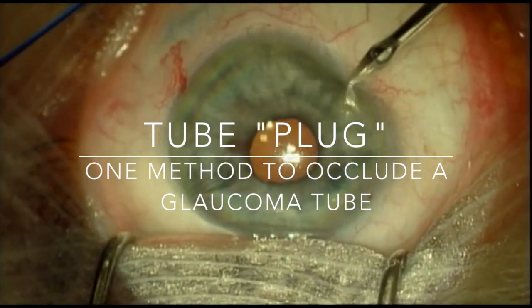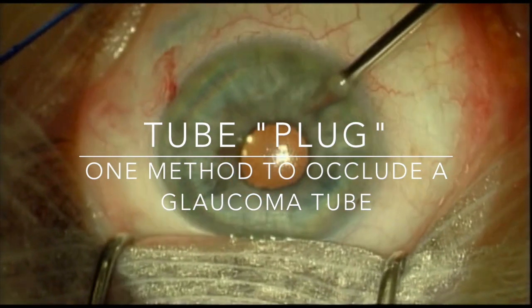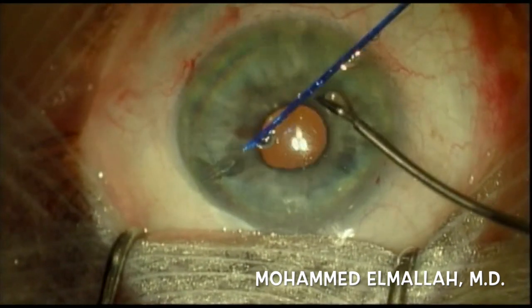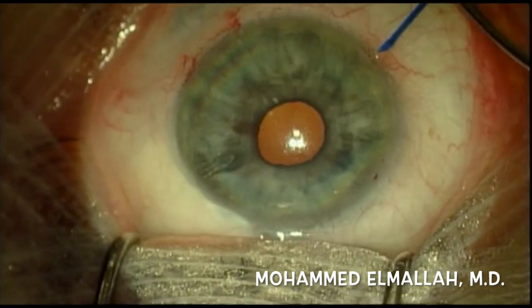This is Mohamed Elmala. I wanted to show one way to close off a glaucoma tube. In this case, it's a Baerveldt tube. This patient had uveitic glaucoma, chronic hypotony, with a resulting decrease in vision.